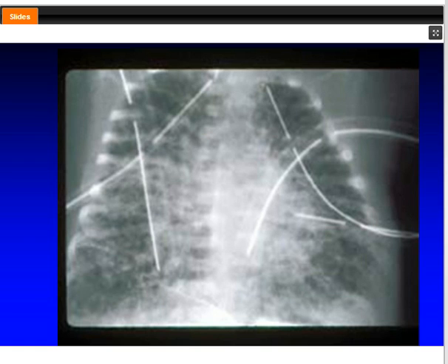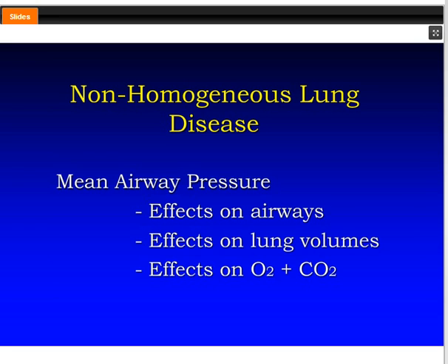so they've got a bad meconium aspiration, the damn thing won't work. What's wrong? And the first question I ask, what's the frequency? And it's 10, 12, and sometimes 15 hertz. All of those are absolutely contraindicated in the meconium aspiration. You want the 5, 6, 7, 8 hertz maximum in those patients, and you will get a much better outcome from them.